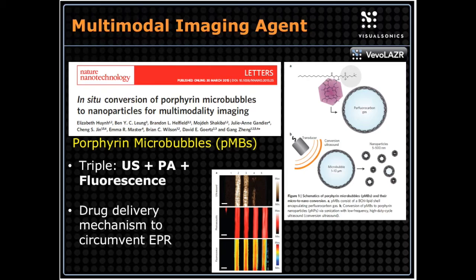And I want to bring your attention to this figure here. It's hard to read, small text, but you can see this is the ultrasound signal. When you've just got the regular microbubble here, we get very, very nice acoustic contrast, just using nonlinear contrast mode on the system. When you convert these bubbles, you actually lose the acoustic contrast. These are pulses of ultrasound that they're using to convert the microbubbles, and as you convert them, the signal from the ultrasound disappears.